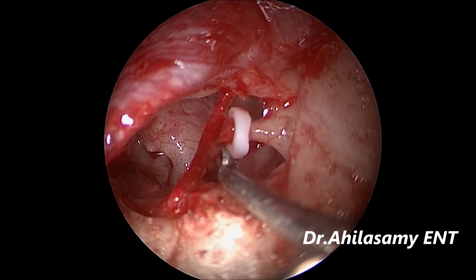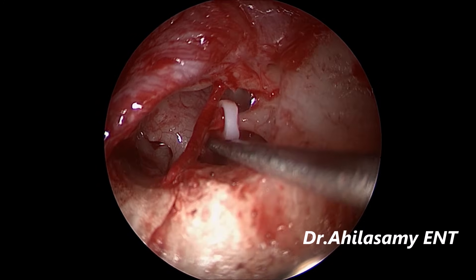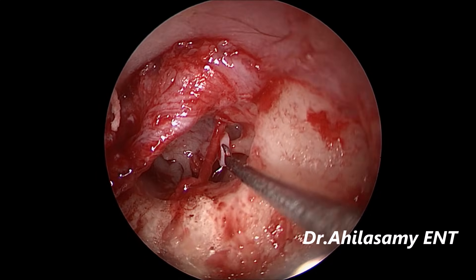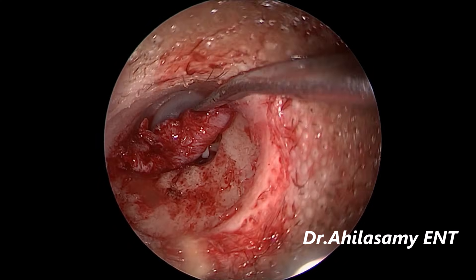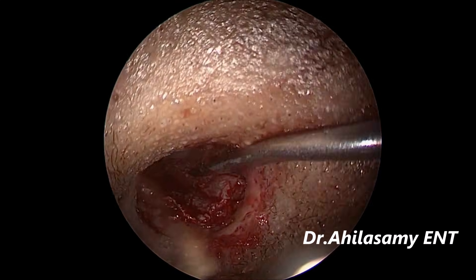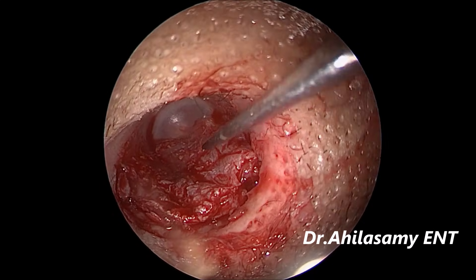Now I am dislocating and fracturing the anterior and posterior crura, and just removing them. Just fast-forwarding the remaining steps — just bending, then replacing the flap.